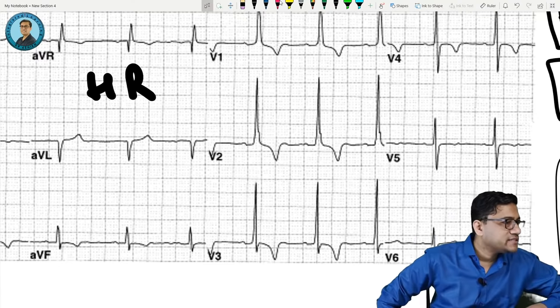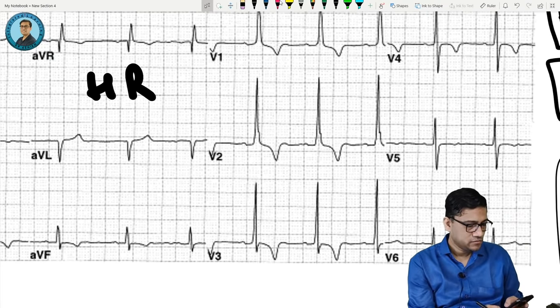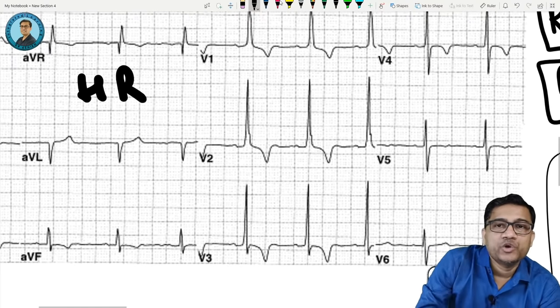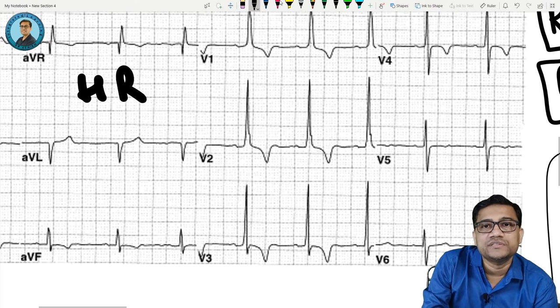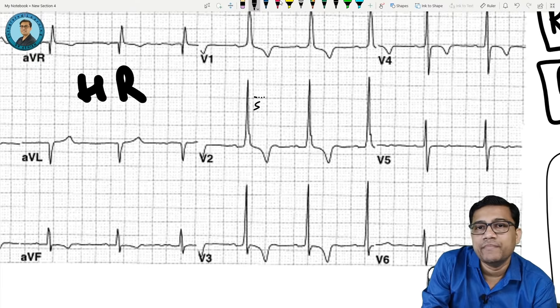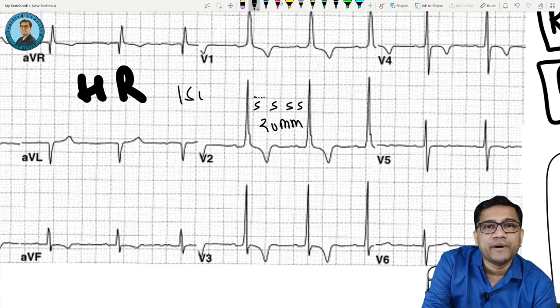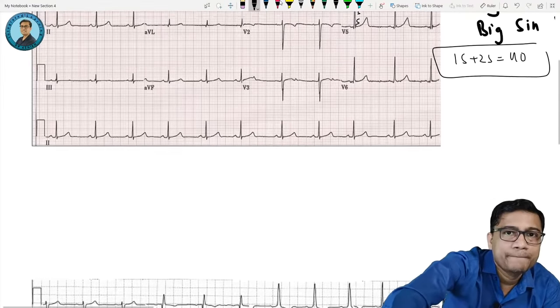Very good, right answers are coming. So understand how many boxes: these are very small, so 5 boxes here, 1, 2, 3, 4, 5 mm, 5 and 5, that is 20 mm. So 20 mm gives us a heart rate of 1500 by 20, that is 75. Very good. Let's do another one.